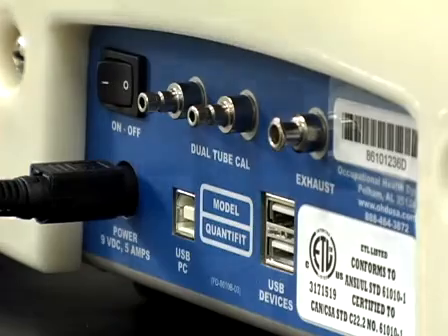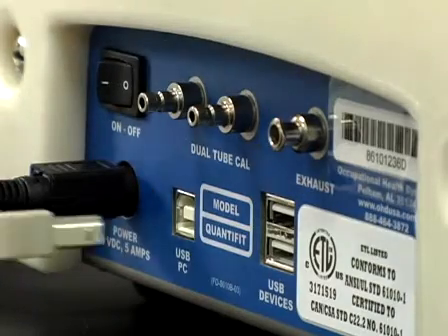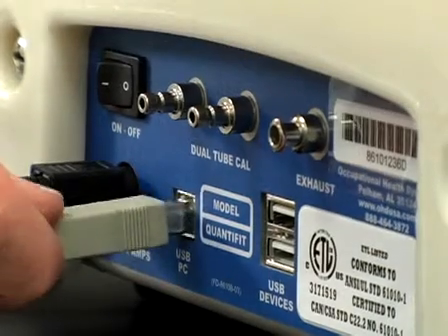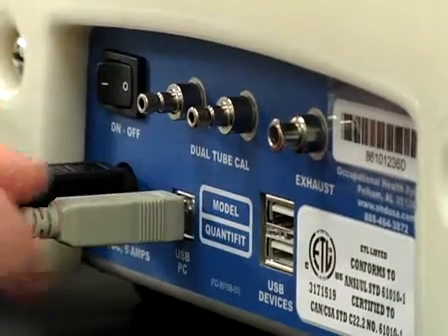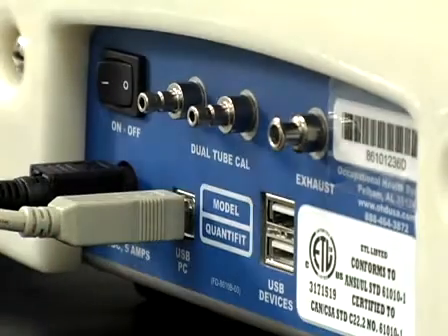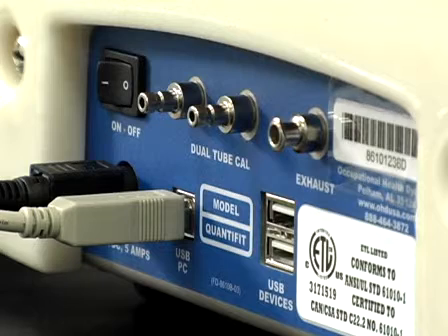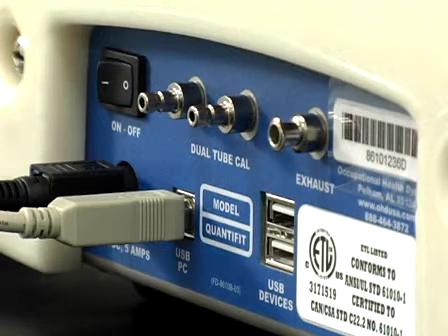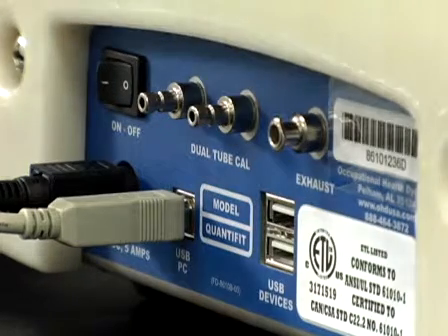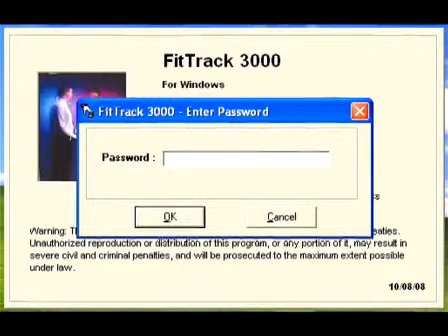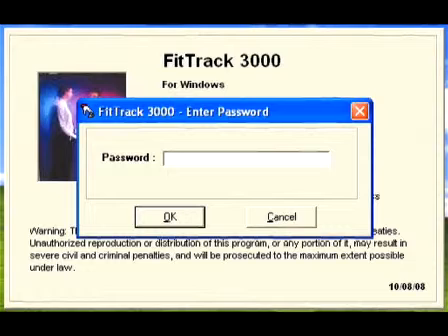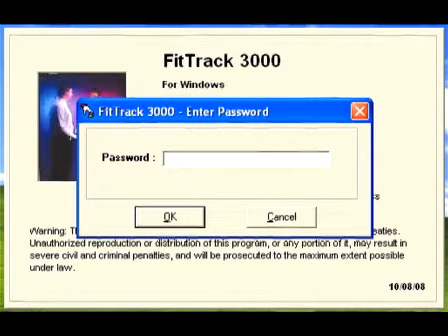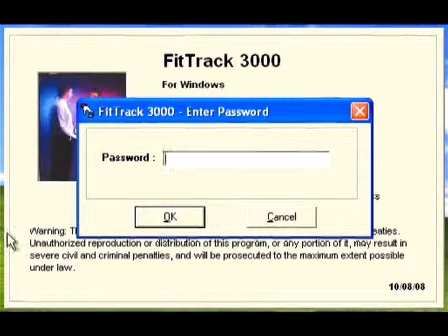After loading and opening the FitTrack software, connect the Quantifit to your computer through a USB port with the provided USB cable. When you open the software, you first see the password screen. You can later assign a password, but when one has not been assigned, you simply click enter.